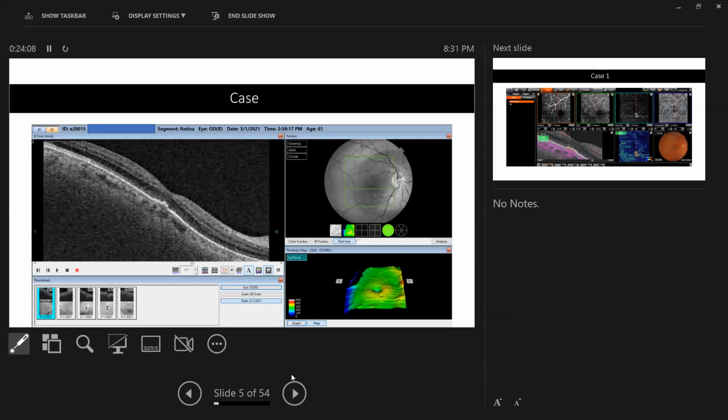Very good question. The hyperreflective foci are actually one of the inflammatory biomarkers. So their presence, especially in high numbers, is an indication that this is an inflammatory-driven diabetic macular edema, not VEGF-driven. Because you know the diabetic macular edema started initially as VEGF-driven, and then with time started to be more inflammatory-driven. So today we have inflammatory biomarkers that can tell you when you need to introduce the steroid. One of them is the hyperreflective foci, the subfoveal neurosensory detachment is another of these biomarkers, and the DRIL also.